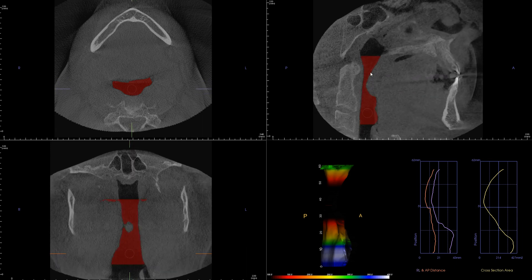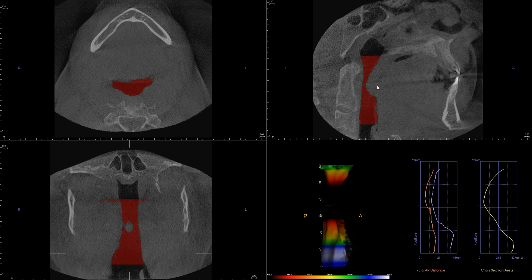Another area to identify: now that you've noticed the constriction is occurring at this level, you may be wondering what this area corresponds to in the mouth. This is consistent with the soft palate — the minimal cross-sectional area is occurring just posterior to the inferior portion of the soft palate. You're also looking at the uvula as well.